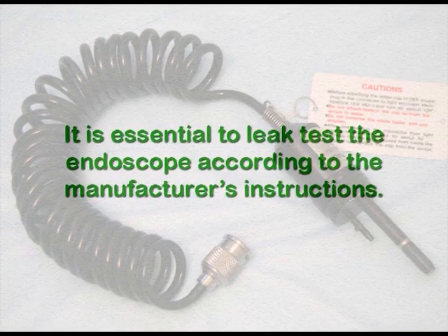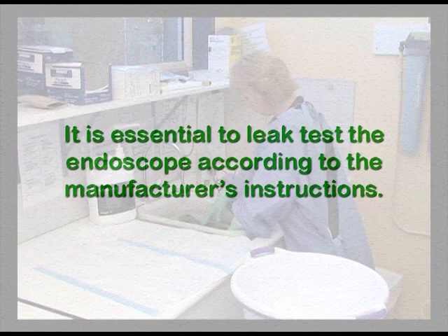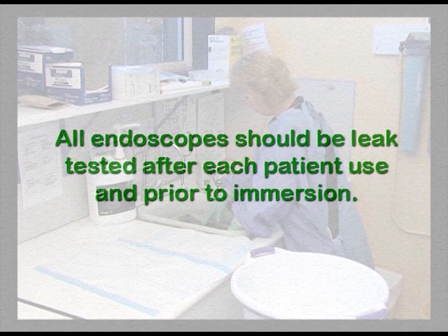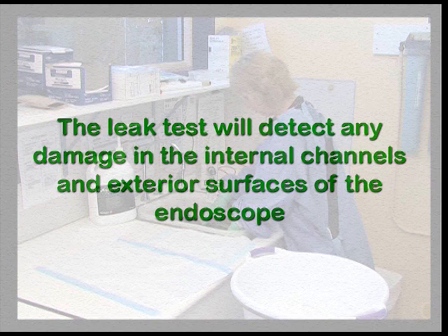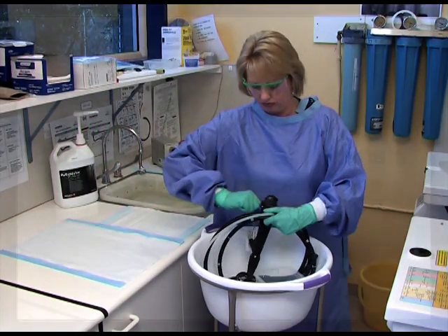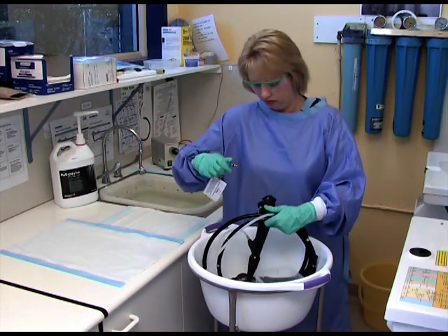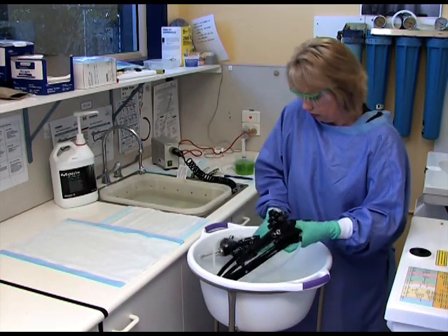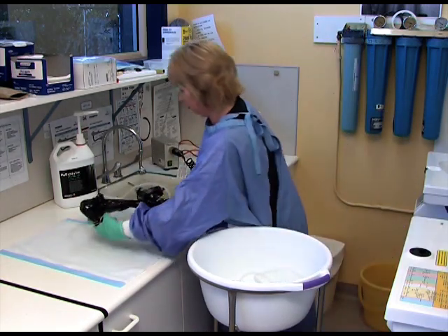It is essential to leak test the endoscope according to the manufacturer's instructions. All endoscopes should be leak tested after each patient use and prior to immersion. The leak test will detect any damage in the internal channels and exterior surfaces of the endoscope. After removing all detachable parts such as buttons, biopsy caps, and flushing adapters, attach the leak tester and pressurise the endoscope.